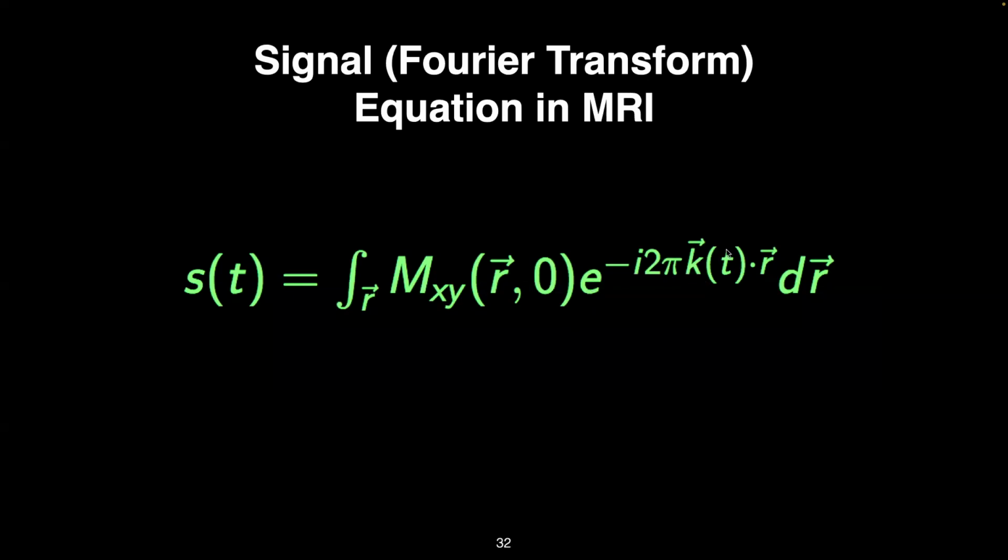And this is saying that the magnetization, coupled with where we are in K space and the effects over position, gives you back the signal that we're detecting over time. And this is just, believe it or not, a simple Fourier transform relationship. So when we take the inverse Fourier transform of this relationship, we can use our signal, put back in the spatial variations we know we're encoding, and recover the image that we want to get, this MXY.